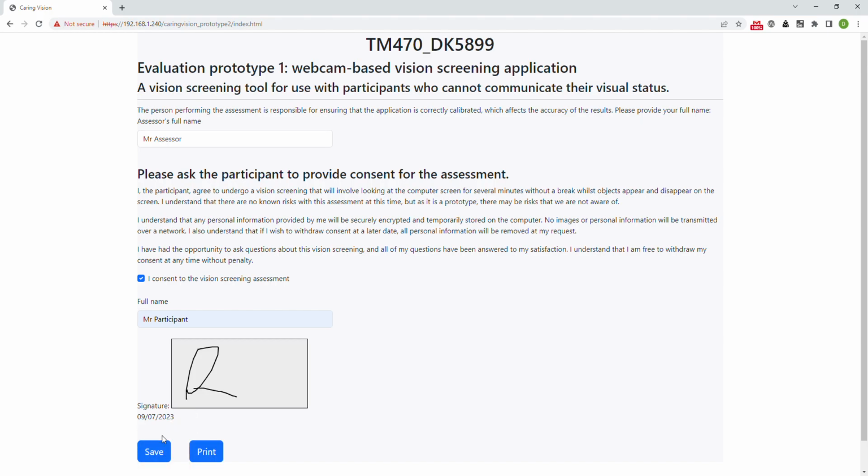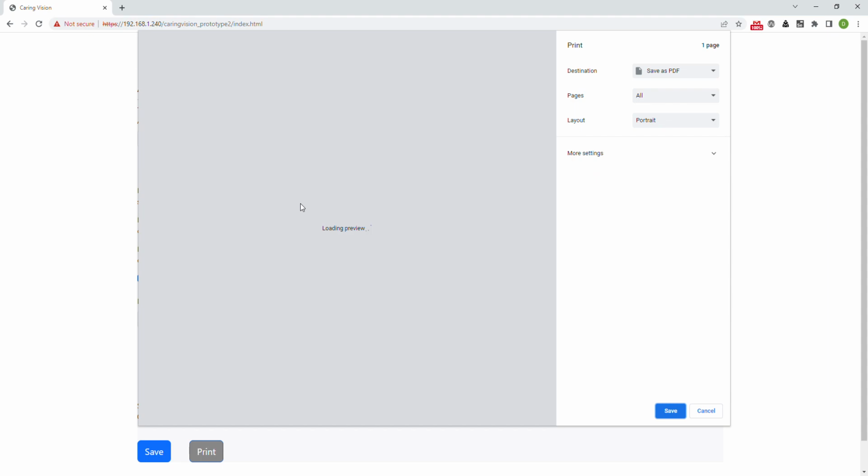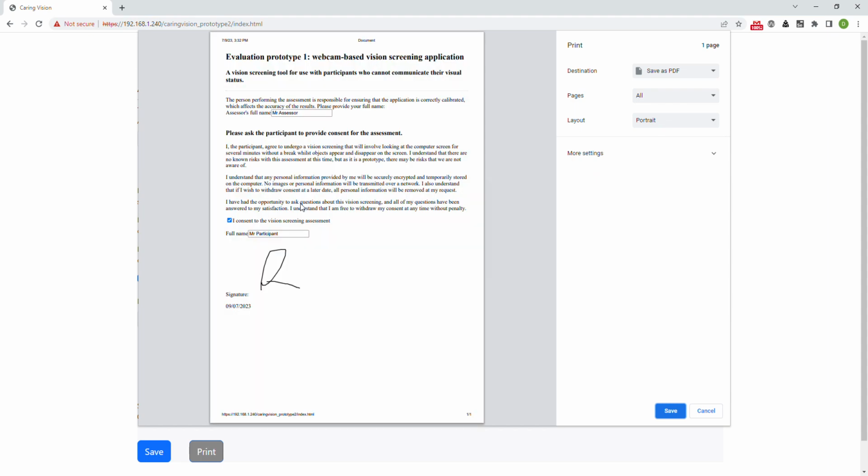And the next option we've got is whether we want to save or whether we want to print. So the reason this option comes up, of course, is it's critical that we have proof that consent was provided, and therefore we either save it onto the local system or we can print it out. In this case, I'm going to click on print, and as you can see there, notice the boxes are now missing. We've taken those off because they're not really important for the form, but the contents there, the signature box is there, and we can save that as a PDF.